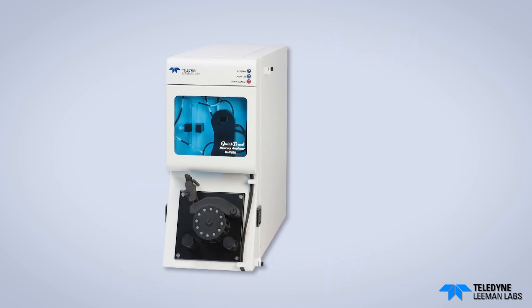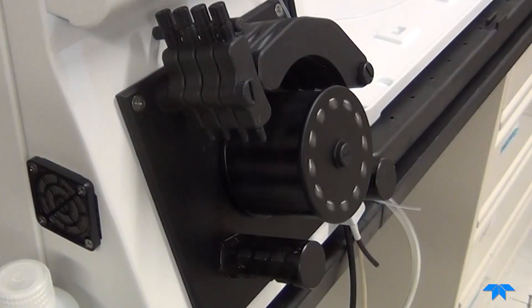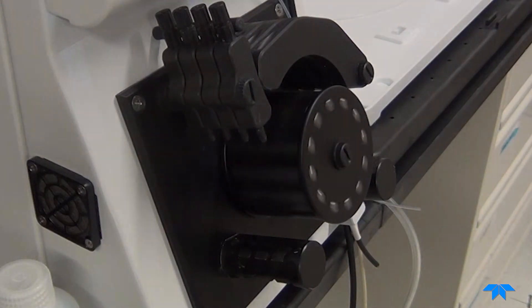We will use the QuickTrace M-7600 mercury analyzer with a standard size tubing harness. Before introducing liquid samples into your system, double check the following items.